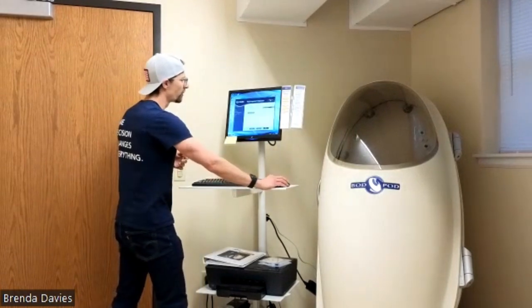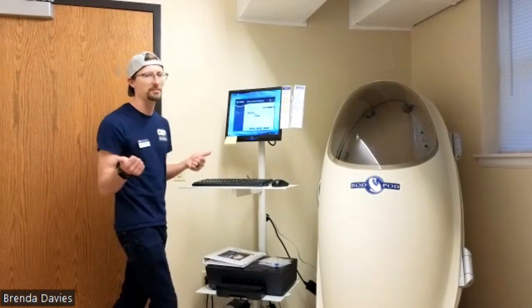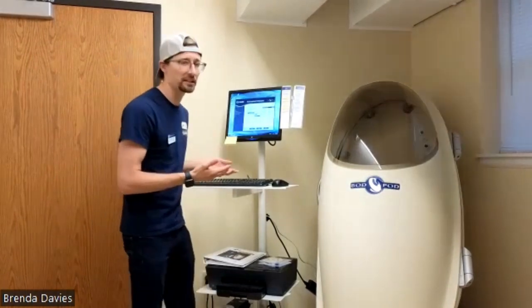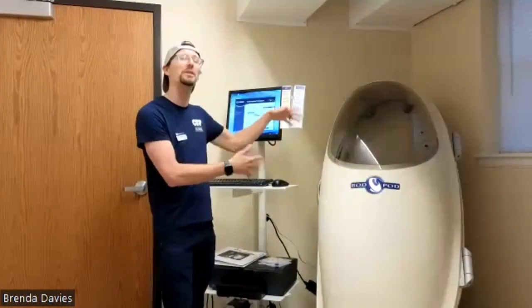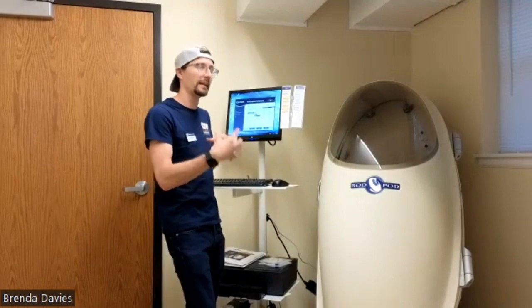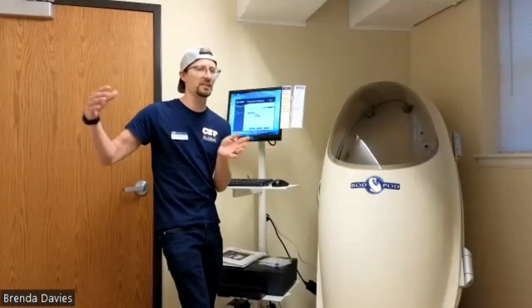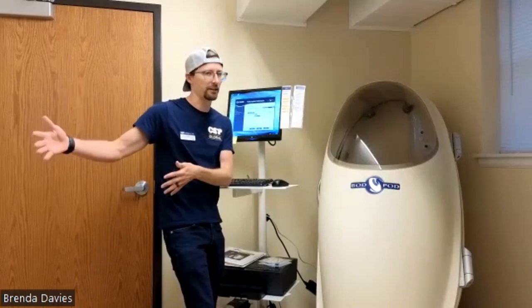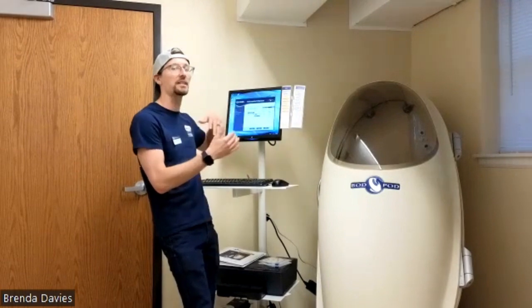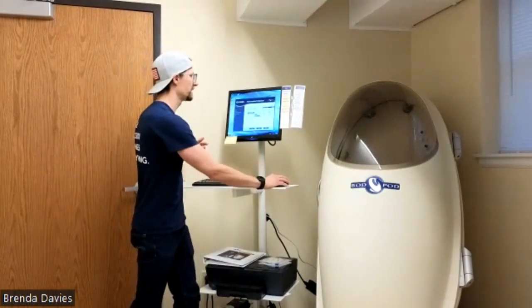And then we would want to determine if we're wanting to measure or estimate the lung volume. The lung volume is an important piece to take into consideration because we have air that we're displacing. Air is also going to be in the lungs. We have to account for that air in the lungs so that we're not making the person seem fatter because they have air trapped in the lungs. So you want to subtract that thoracic gas volume to get, again, an accurate body fat percentage.